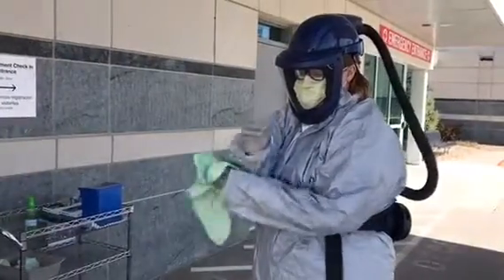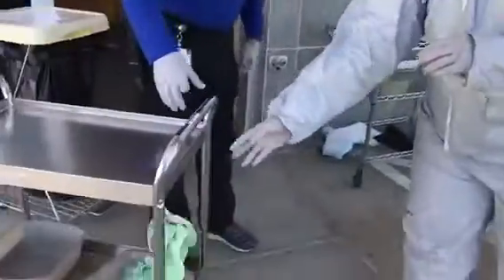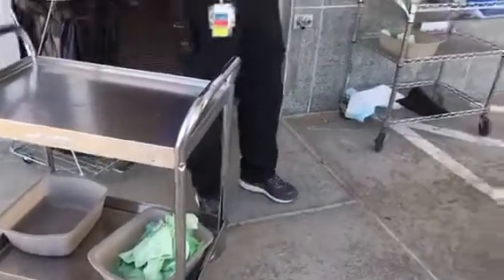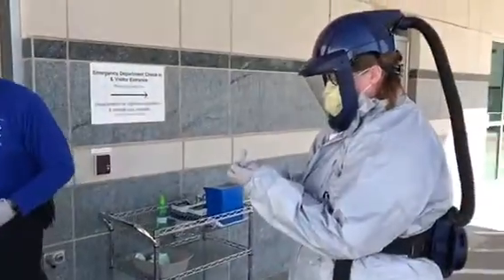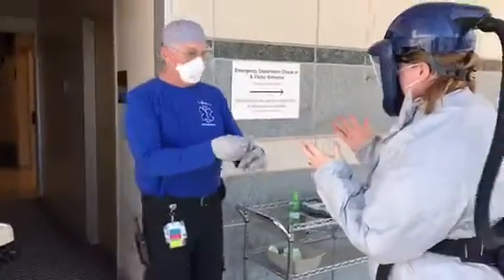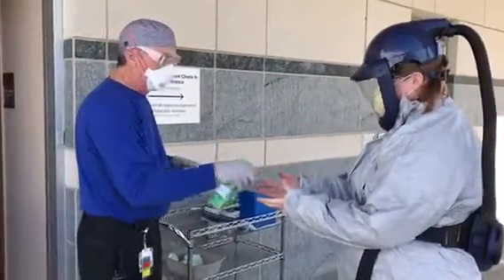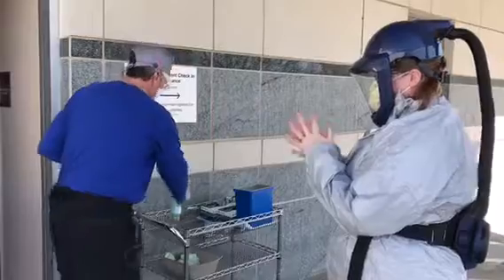And then they will put the dirty rag in the dirty linen bucket. They will remove their gloves and throw them in the trash can. And then put hand sanitizer on. And then a new pair of gloves.